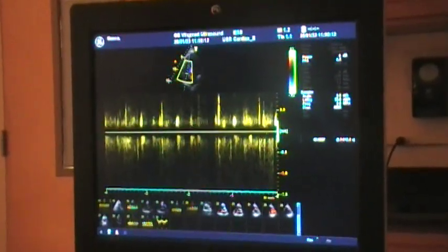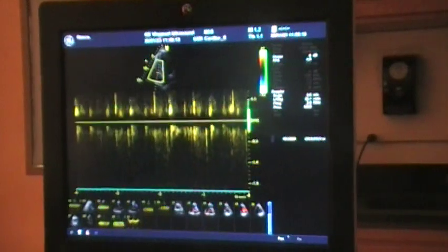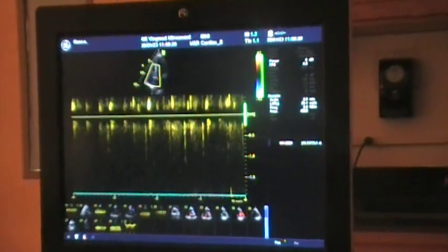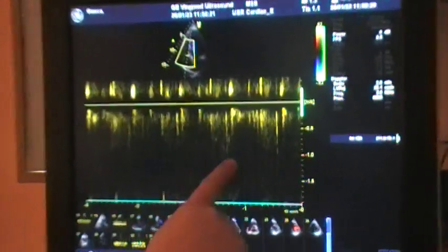But normal flow would be above the baseline in diastole. So this is continuous wave. Continuous wave again, sorry. And it's just looking for it again. We looked for it in our parasternal long inflow view, and we looked for it in that short axis too. But there's just that little tiny bit right there again. And you're just going to do tricuspid valve Vmax on that right there.